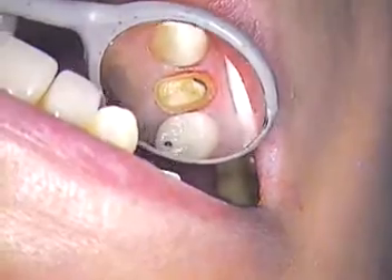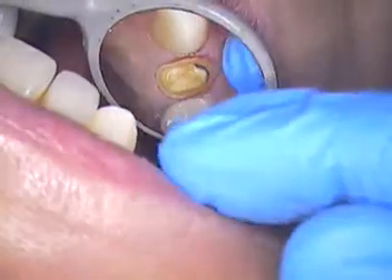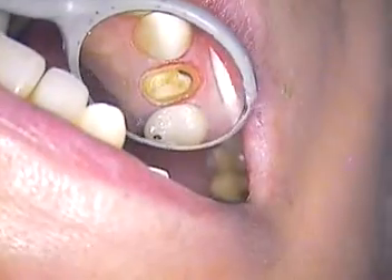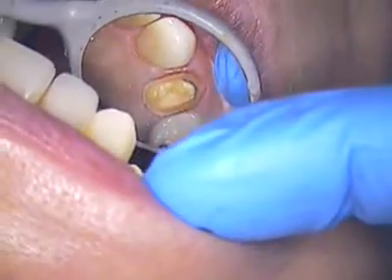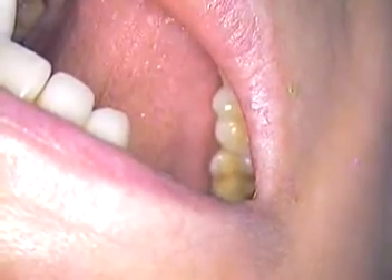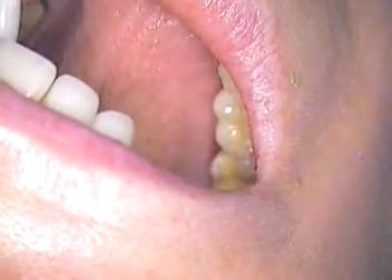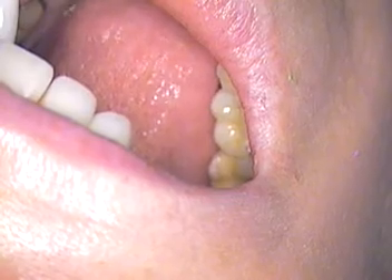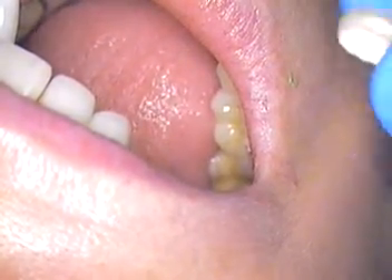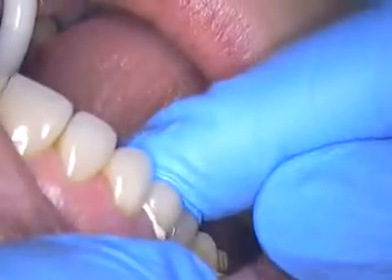It goes through a set phase — from a doughy phase to real sticky, then doughy again, and finally you can clean it off. We set the timer to about a couple of minutes from seeding. And we do coat this with Vaseline before we cement it.